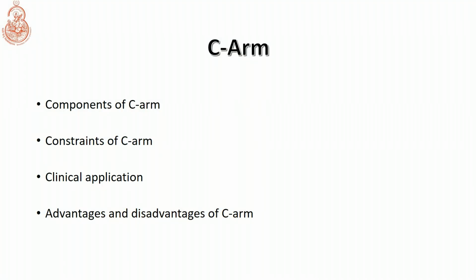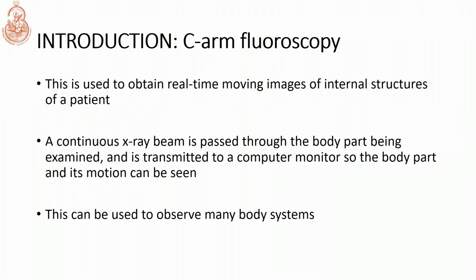Today we will learn something about the C-arm. We will learn about the components of the C-arm, the constraints of the C-arm, the clinical application, and the advantages and disadvantages of the C-arm. Let's start with the introduction.